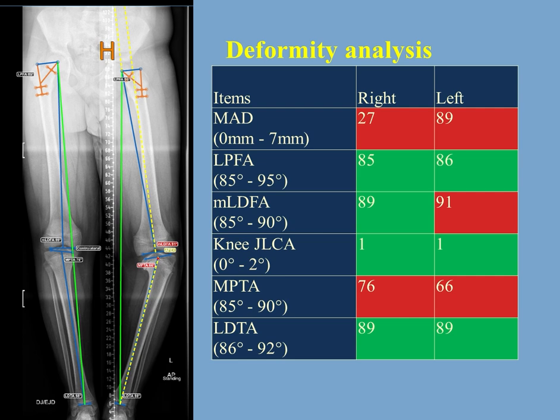There are 2 other deformities that are not immediately visible in this chart. The first is the rotational deformity of the tibia, which we alluded to earlier in the clinical examination section. There are 30 degrees of tibial intorsion on the left side, which we should consider during the correction process. The other deformity is the leg length difference. Now, because of the deformity, the actual deformity and at maturity, they should be calculated and accounted for. During the procedure we are planning to obliterate the growth plate completely in the left proximal tibia. So the child most likely is going to lose around 6 mm each year.